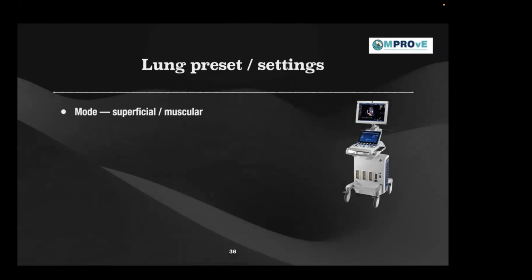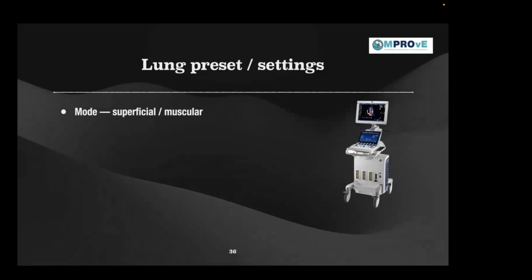For the mode, we always use superficial or a muscular mode, because we're going to use a high frequency probe, and we are trying to look at a very superficial structure with very good clarity. So we always use a superficial or a muscular mode or a vascular mode. All these are superficial structures.